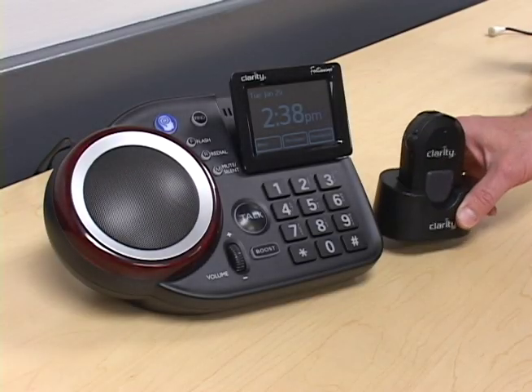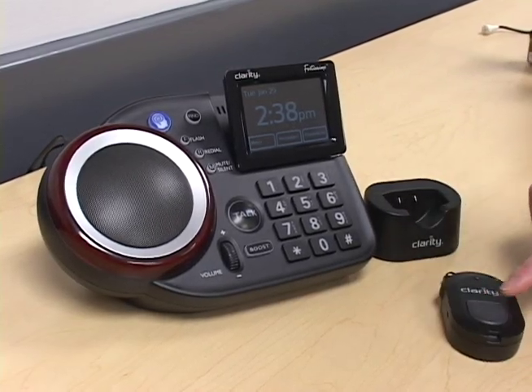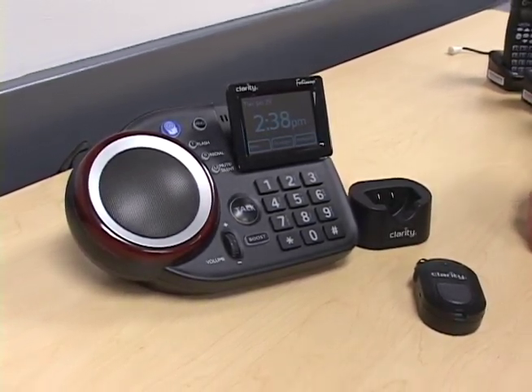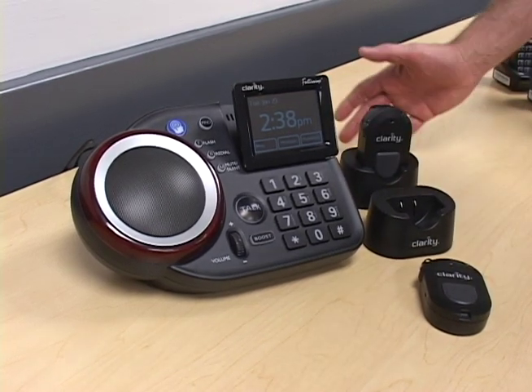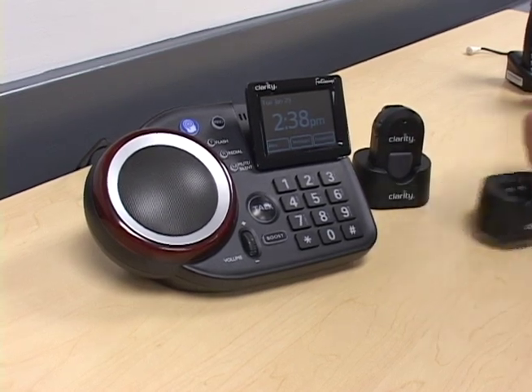You can pair a remote pendant to the Fortissimo so that you can make a call, receive a call, or dial from your phone book. You also can pair a second pendant so that you always have one on reserve that's charging, so that if the first one powers down, you can then use the second pendant.